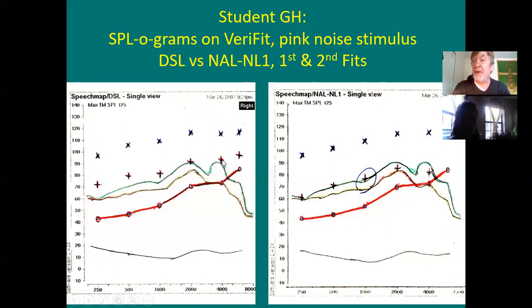Then we programmed the hearing aid on the manufacturer software to hit NAL 1. And it looked rosy groovy on the software. Moved it over to Real Ear. You're below target. Look what we had to do to match the target.